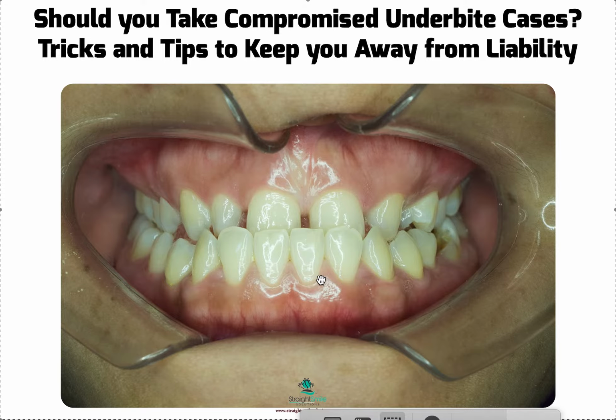So it may not be as bad as you think, right? So that would be my first step with this. Once you know exactly where it is, of course, you're going to have to get a Ceph. You have to get a Ceph. So if you don't have access to a Ceph machine or you don't know how to get access from somewhere, you should have no business taking this case. Don't take it. You need a baseline Ceph. Get baseline Ceph numbers.